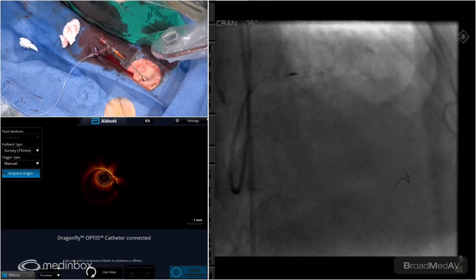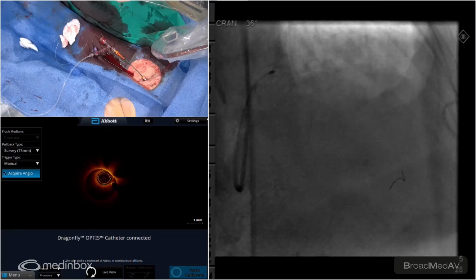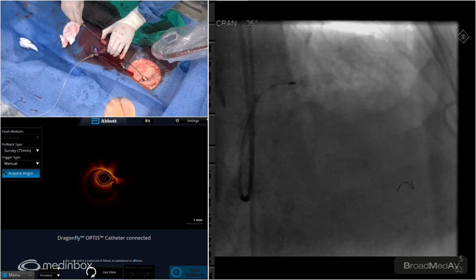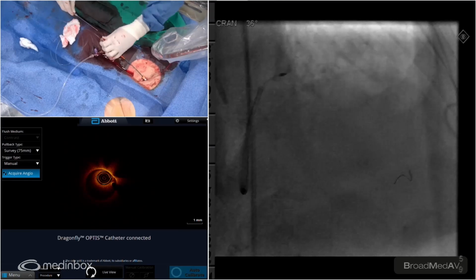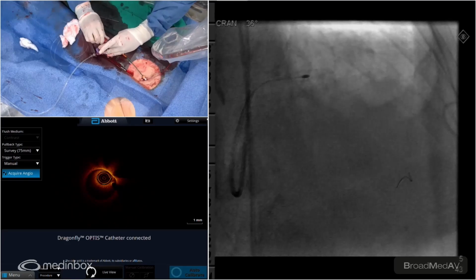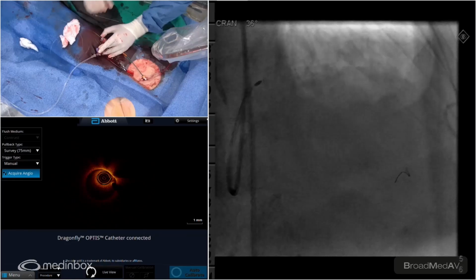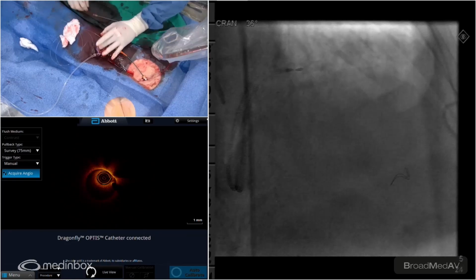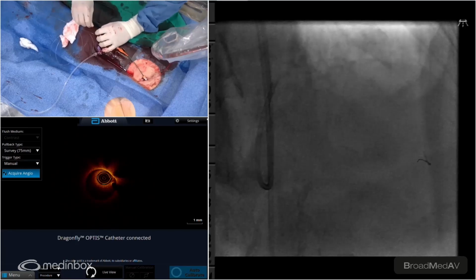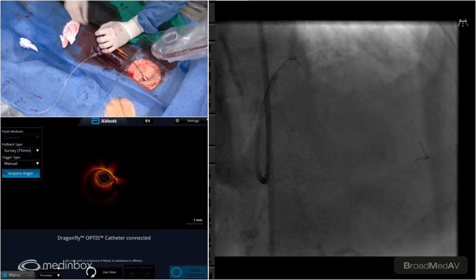So people classically talk about the duck sign as the burr is burning through. So I'm just going to leave this here. Wow, this thing is too tight. Back on. I just get stuck into that mode. Yeah, the duck sign, as it burrs into deep calcium, I really want to understand how thick the calcium is, and whether we need to do any aggressive burring, maybe with a larger burr.